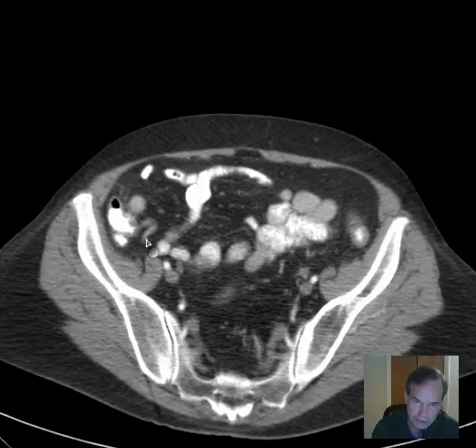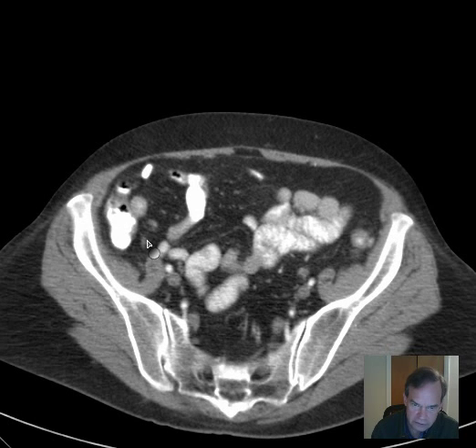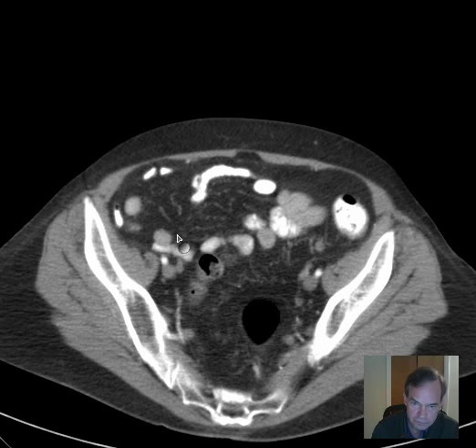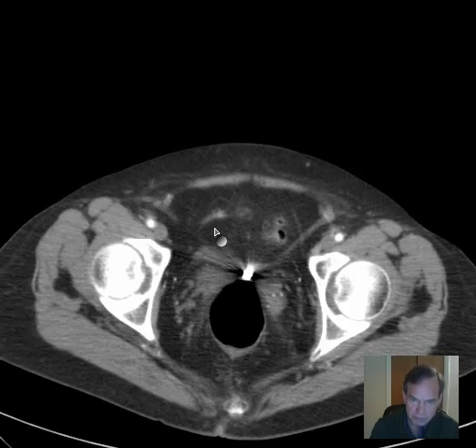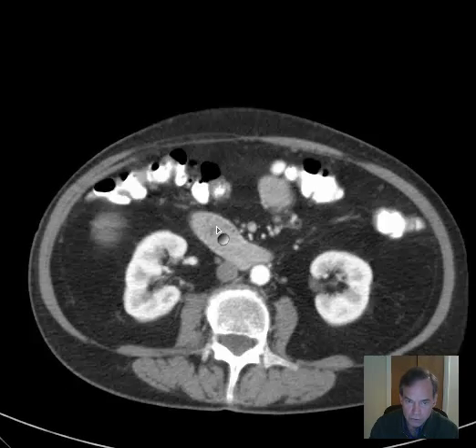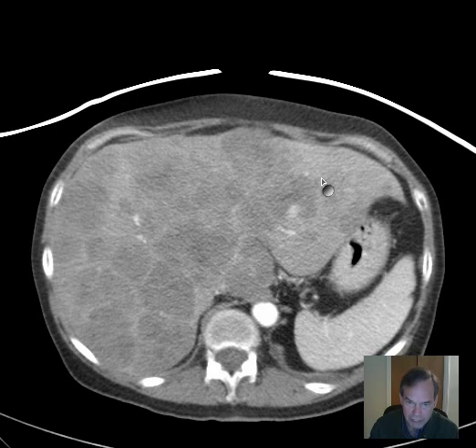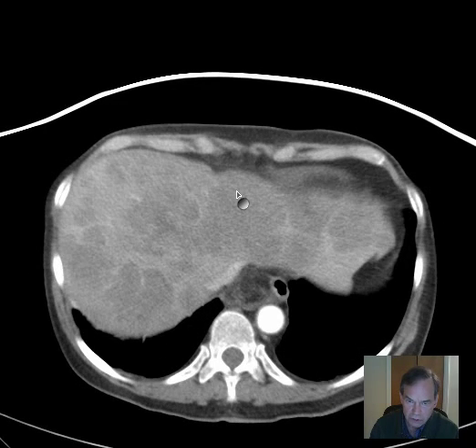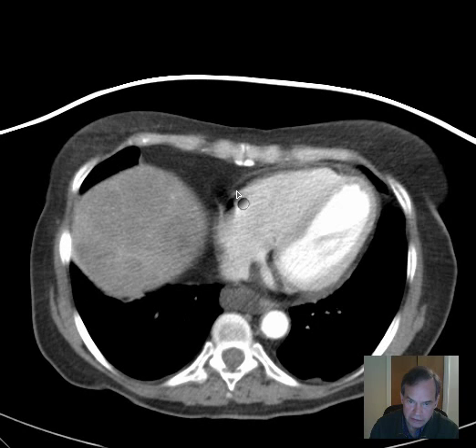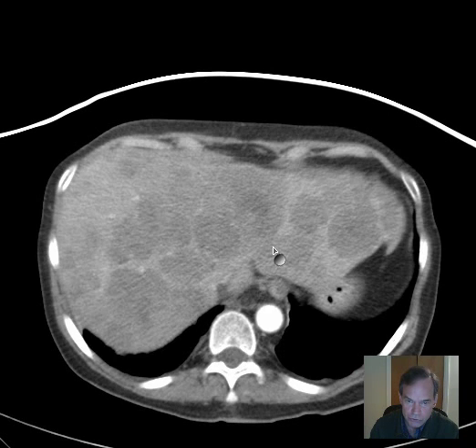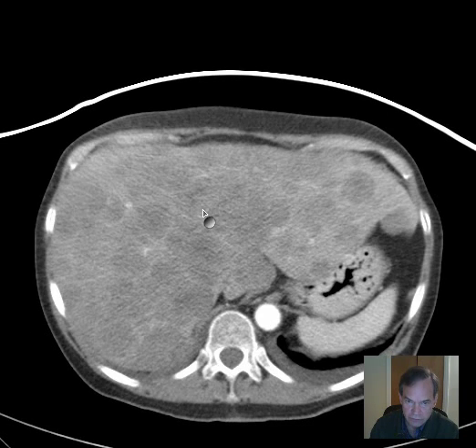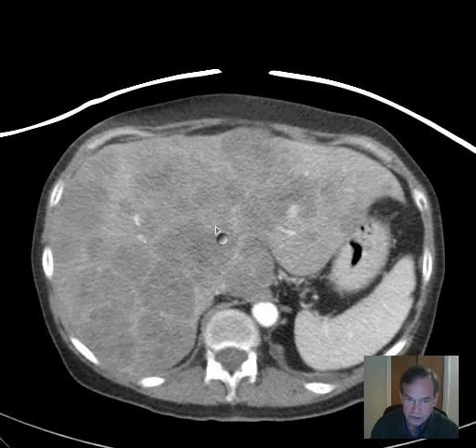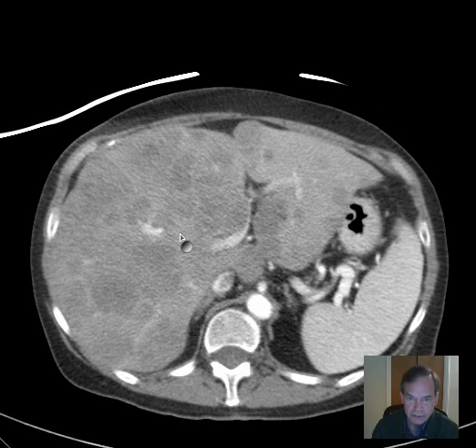Again, our home base marker here — the appendix — confirming the anatomy. The cecum. No free fluid in the pelvis. So a fairly dramatic example of a gastrointestinal carcinoma, in this case an esophageal carcinoma, producing extensive cannonball metastases throughout the substance of the liver.